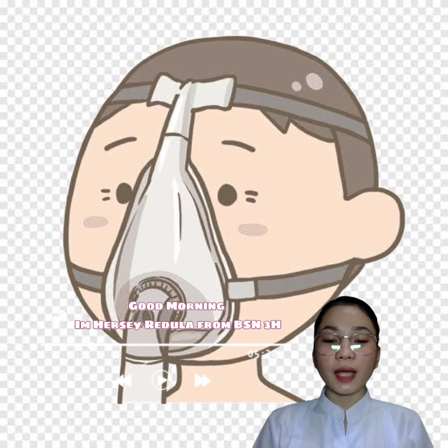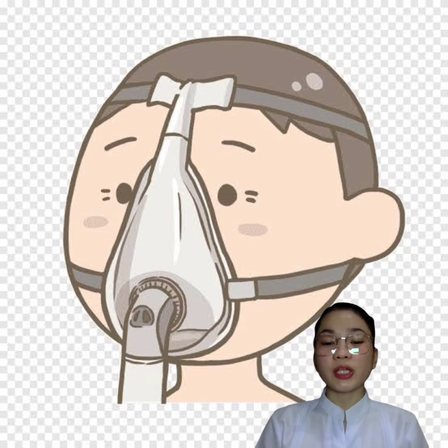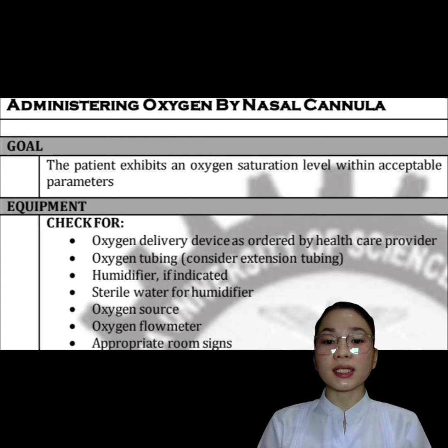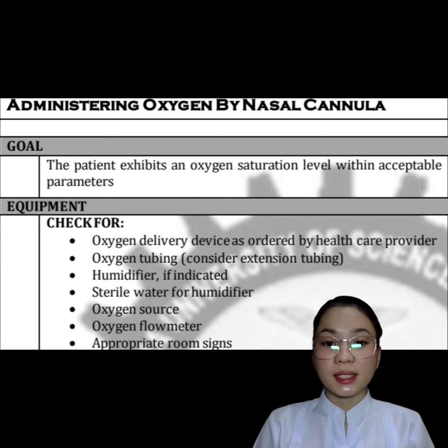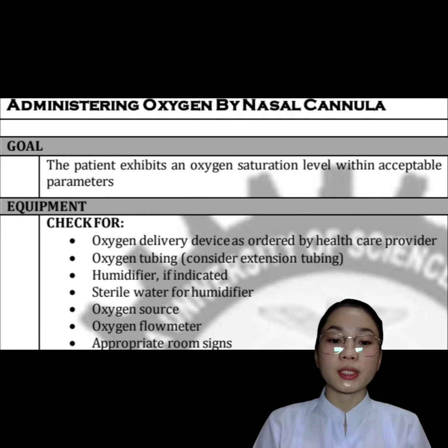Good morning, sir. I'm Hershey from BSN 3H, and now I will be performing how to administer oxygen by nasal cannula to the patient. So for the goal, the patient exhibits an oxygen saturation level within acceptable parameters.